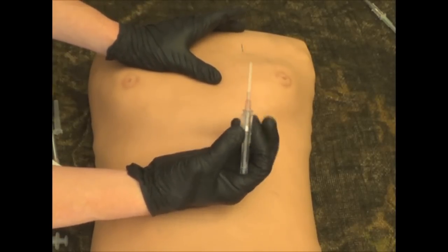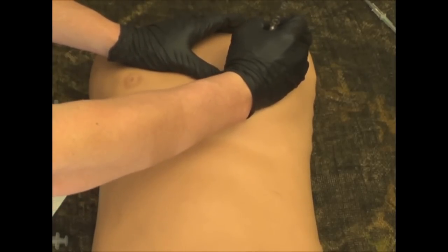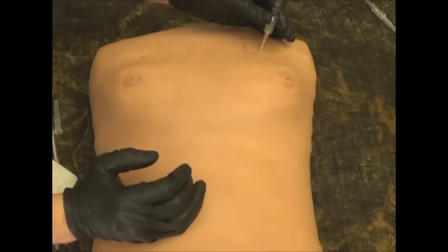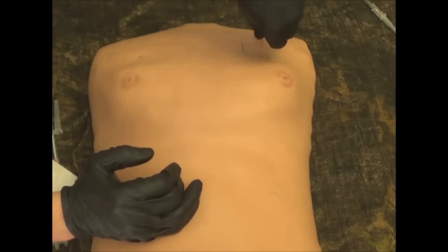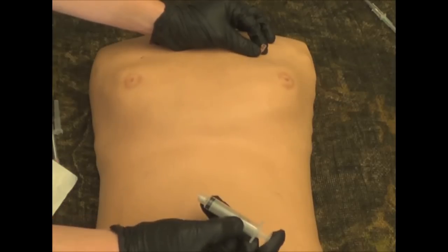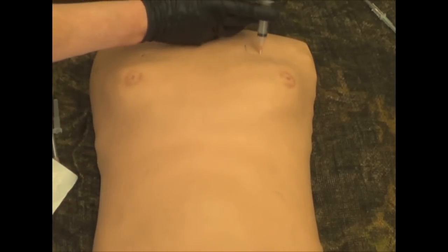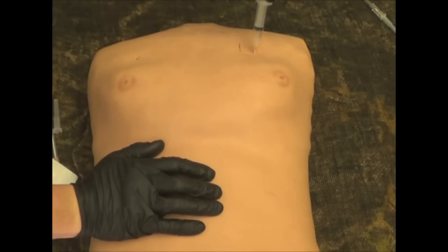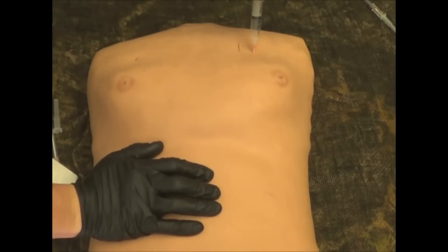I'm going to use a smaller needle — this is a 20 gauge — but go straight in. You'll feel it hit the rib, go up over the rib, you'll feel the needle slide, and insert it all the way to the hub. The needle goes into a sharps container. You may see some blood start coming out, or you may hear some air coming out. The easiest thing to do is take an empty syringe, attach it to the hub, and simply withdraw. If you get air, you know you're in the pleural space and you're in the right spot. But you may also be getting blood too, where blood is building up into the chest cavity.